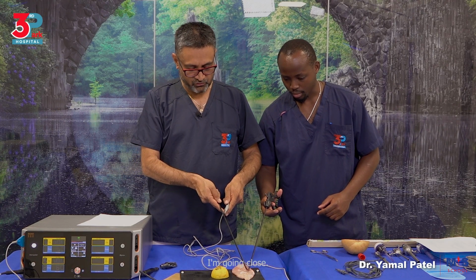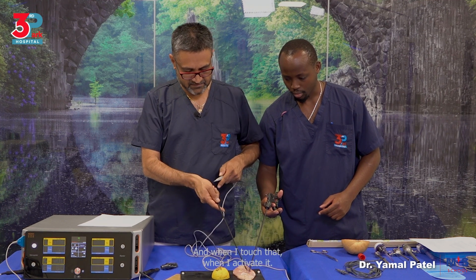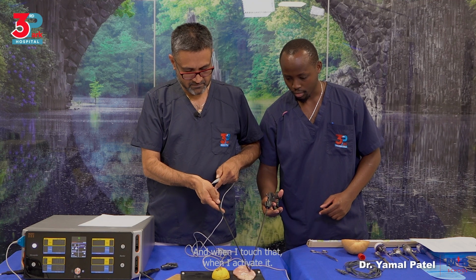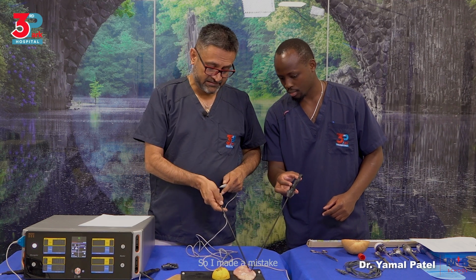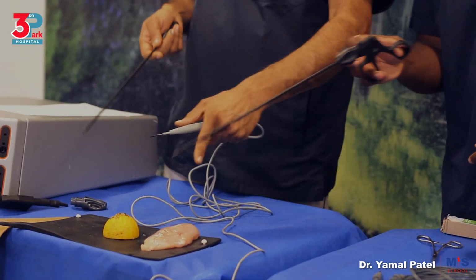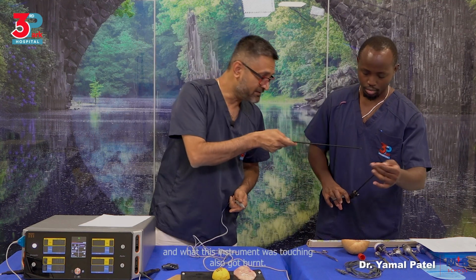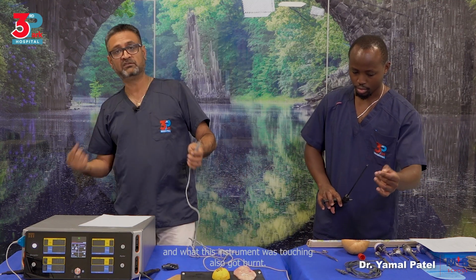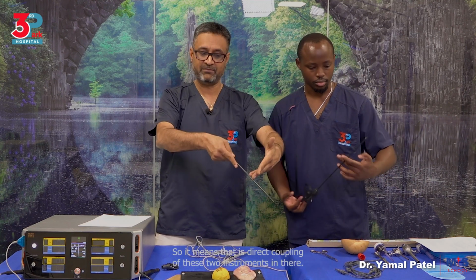I'm going close, and when I touch that, when I activate it, I made a mistake of touching the other instrument that this thing was touching. So what I was touching got burnt, and what this instrument was touching also got burnt. So it means that is direct coupling of these two instruments in there.